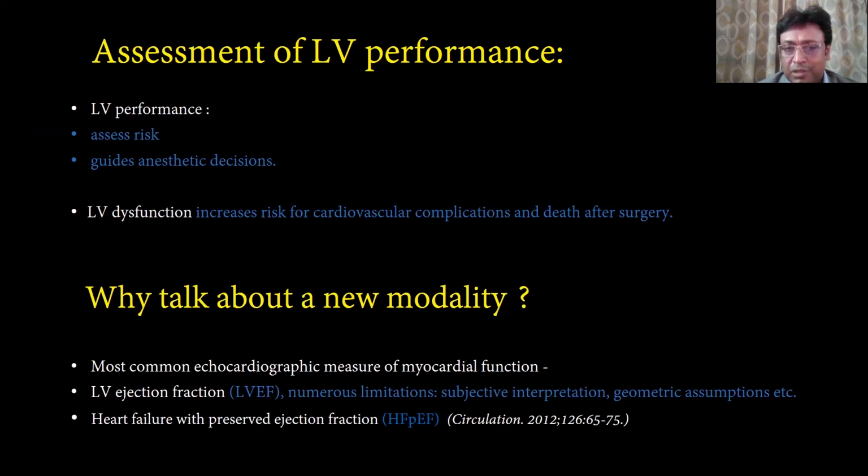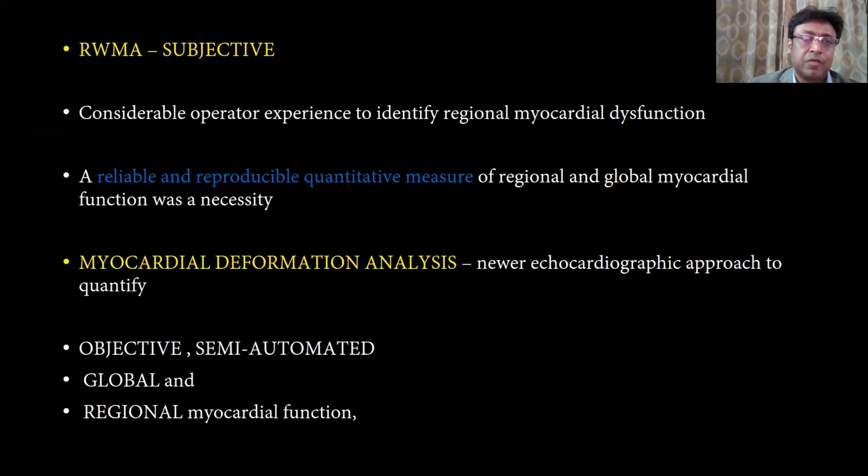So assessment of LV function is important, but LVEF has numerous limitations, including subjective interpretation and geometric assumptions. But I think the most important limitation is that more than 50% of heart failure patients would have preserved ejection fraction. So ejection fraction per se cannot be the singular modality for assessment of risk. Moreover, for assessment of RWMA, regional wall motion abnormalities, there are considerable operator experience requirements, and it is subjective.